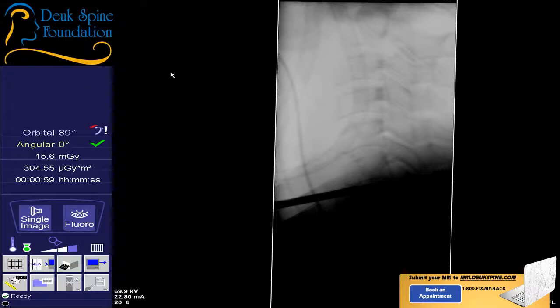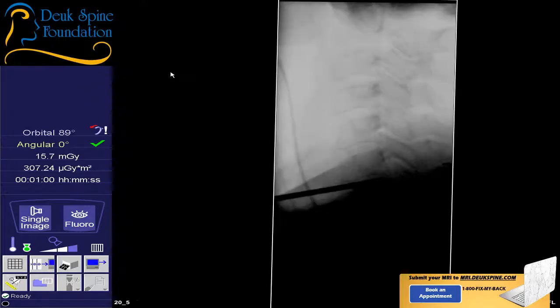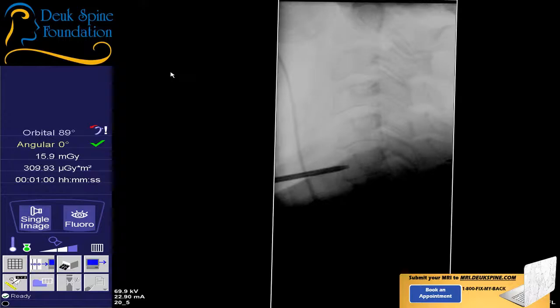I got it. All right, now we're going to slide this out. Give me another pull and take a shot. Well, that's much better, guys. Just hold it right there for a second. Shot. We are out. I need an AP. Just stay where you are. Don't move. I'm almost done with you guys. 30 seconds. Give me a quick AP. I need to see where I am on the spine.